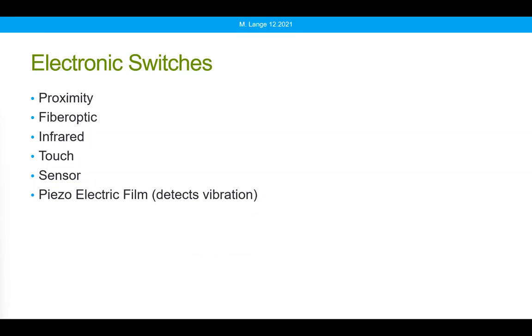have movement, what's their active travel range and force. And then as best as you can determine which of those movements are most likely to persist and put those switches there. As the client continues to progress, you will undoubtedly need to change the position and or type of switch. We'll see that in a case study coming up, but it's certainly not uncommon that we need to continue to follow these clients and change as they change.